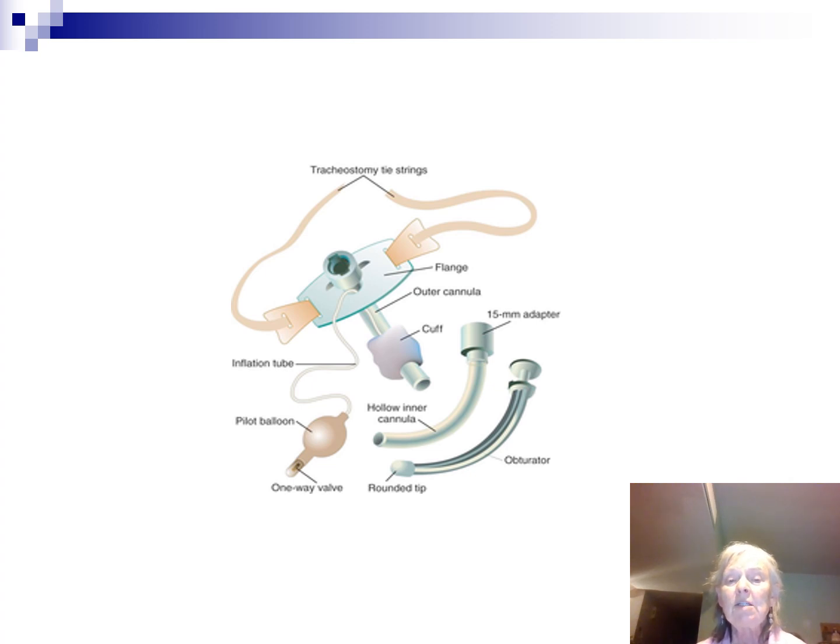One of the things that's happened with this on occasions is that people will be tube feeding patients and the feeding tube falls out, they'll go ahead, pick it up, and put it into our pilot balloon, and then they're actually feeding the cuff. And unfortunately, the cuffs will rupture on occasions, and now the patient is aspirating. So you always want to check and make sure that everything is the way it needs to be.